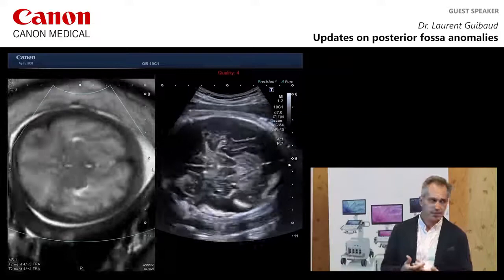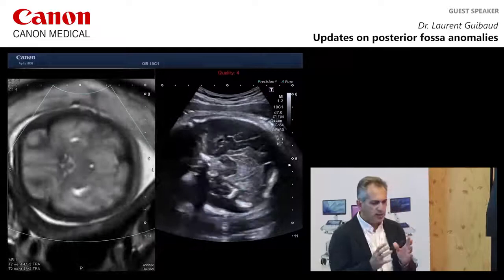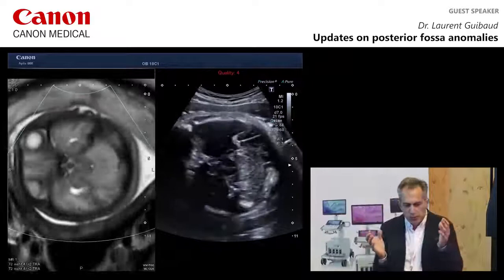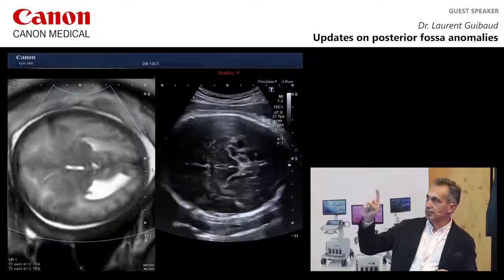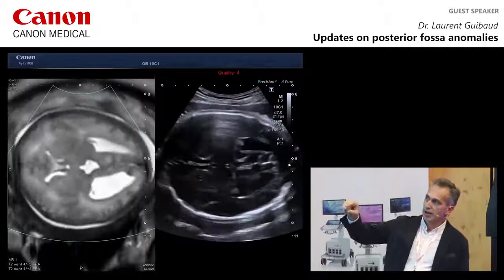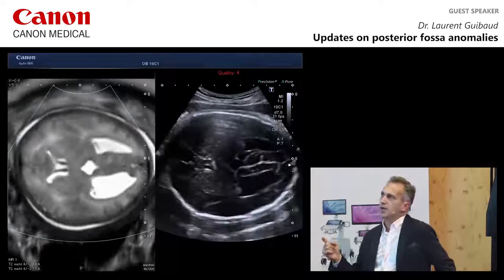And when I discuss with a student about Chiari malformations, it's difficult to understand why in Chiari malformations it's very difficult to analyze the posterior fossa. Because in fact, there is disappearance of the pericerebral space, and because the size of the posterior fossa is reduced. And here, you can easily understand because we have the exact correlation between absence of the fluid surrounding the cerebellum, the banana sign of the cerebellum, which is typical for Chiari II malformation. And because of that, most of the time, there is dilatation of the ventricular system.